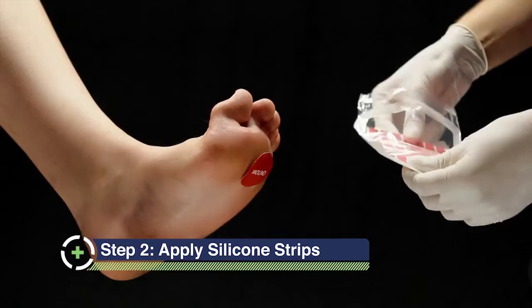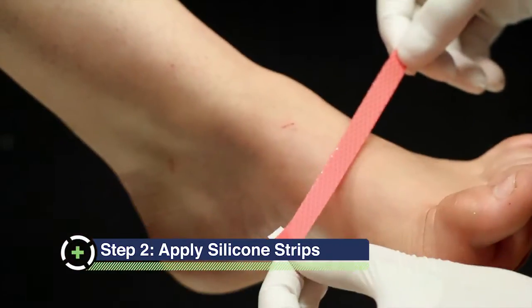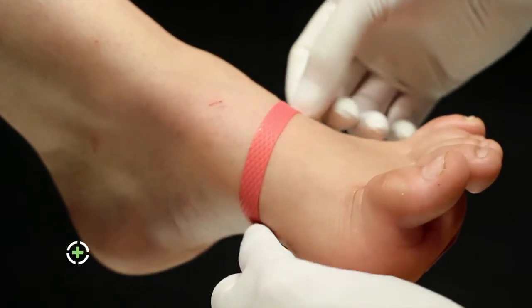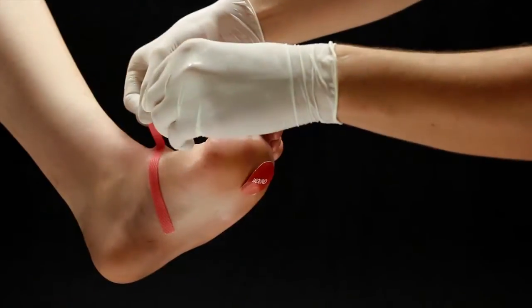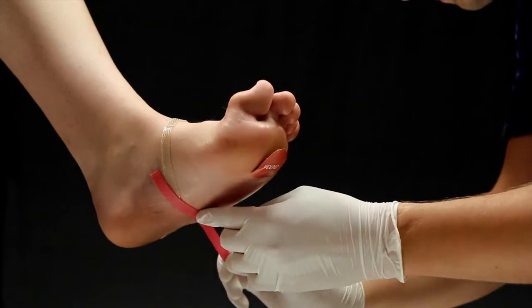Remove the silicone strips from the packaging. Place the strips in a contiguous pattern around the foot, proximal to the body from the wound bed. Make sure to remove the red backing. Use two side-by-side layers and overlap the edges to completely encircle the foot.